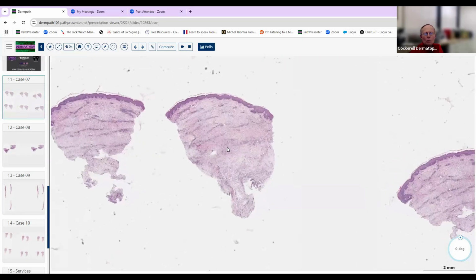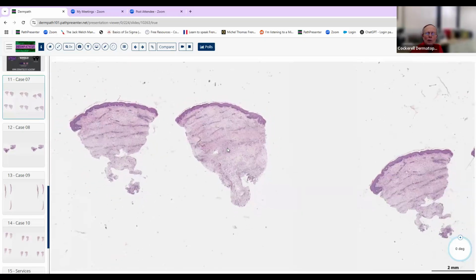So this is one you probably, again, are not going to get on the board examination, but we can learn anything from any biopsy that we get. So we'll just kind of take what we get here. Sometimes our teaching cuts don't show the classic features that we'd like to see on the original one, but there's always something to learn on a biopsy.